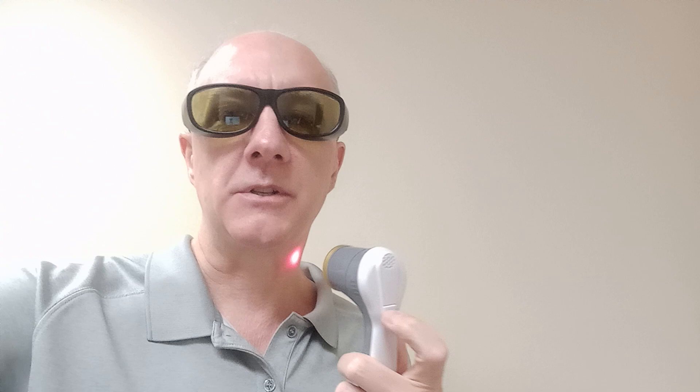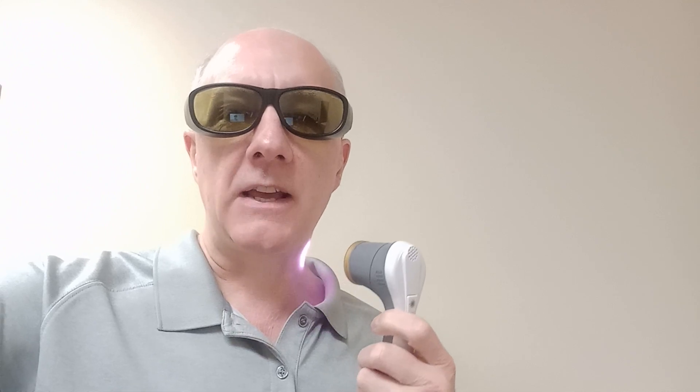The red laser is just an indicator light — it's five milliwatts, just to tell you the machine is active and ready to be turned on. There's this little button here I'm just going to press, and you'll see all this extra light. The camera is kind of interesting. This laser is putting out energy, and normally you do this right on the skin. You can keep it moving around — you can go slower, you can go faster. And I feel warmth from this, so this is a hot laser.